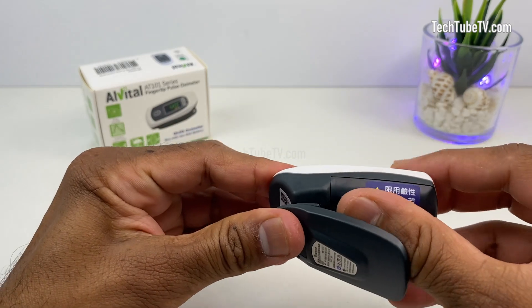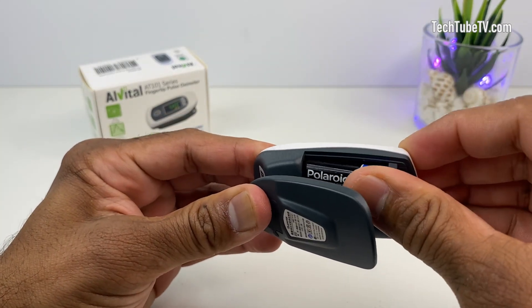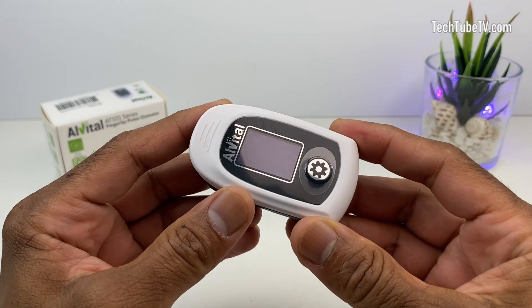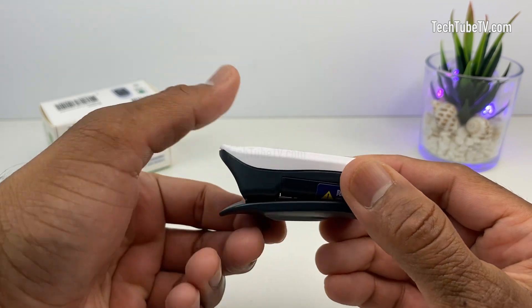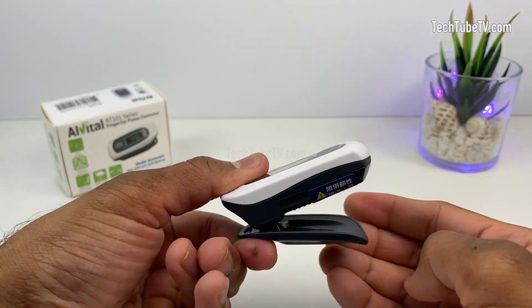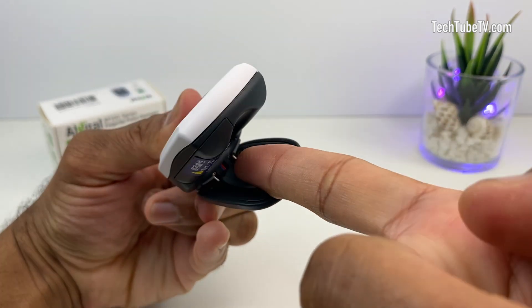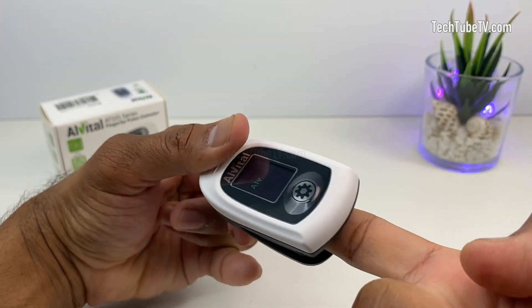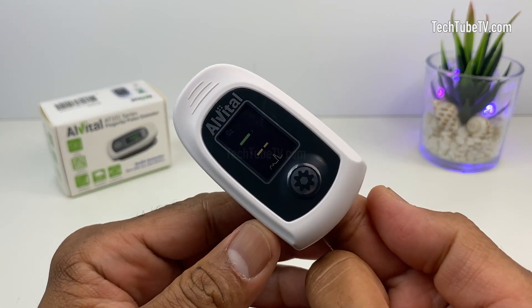Before using this pulse oximeter, insert a triple A battery — one is already provided in the box. This device is actually very easy to use. Press to open up the oximeter and put one of your fingers into the opening. Make sure the finger is facing up where the sensor is, and then release the clamp. The device will turn on automatically once a finger is inserted.